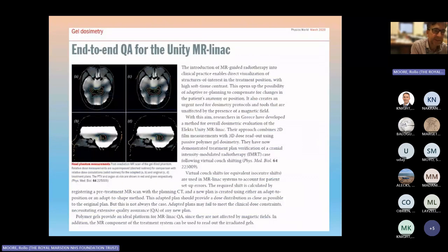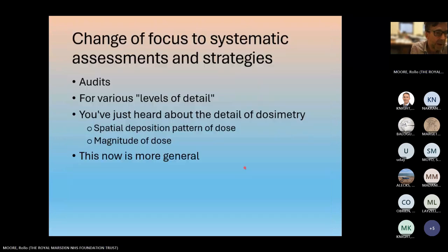And I just thought I'd put this slide in because as we move forward in Marsden towards MR guided radiotherapy using the combination of a MR scanner with a LINAC, which is a complicated technical challenge, the RT safe gel system is ideally situated because not only can you irradiate and plan the dose, you can read it out in the same system.